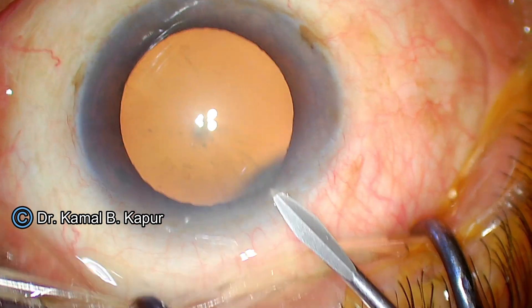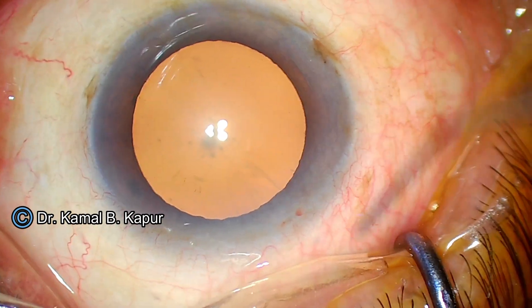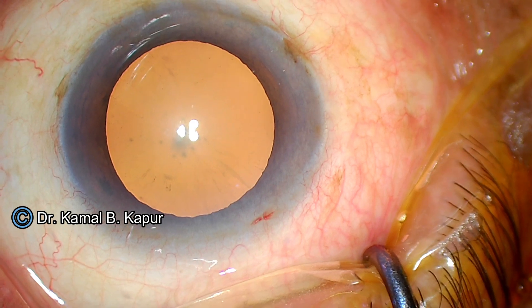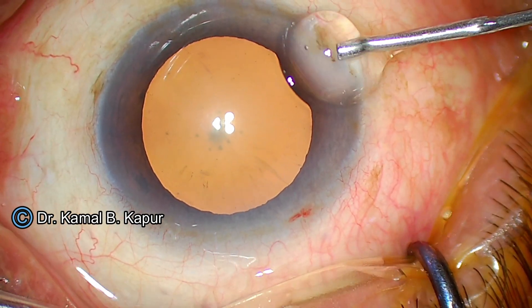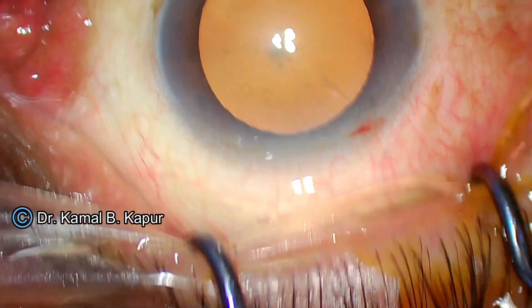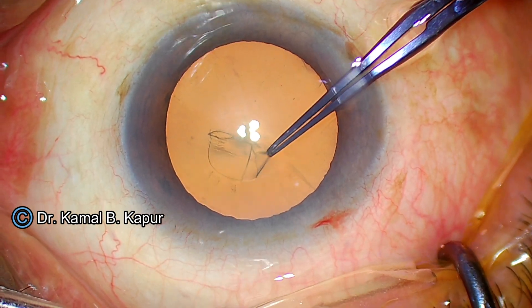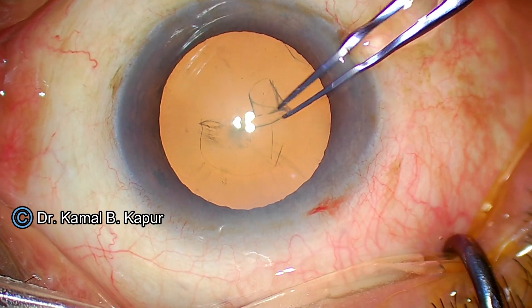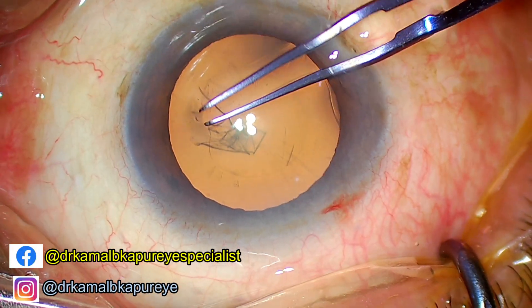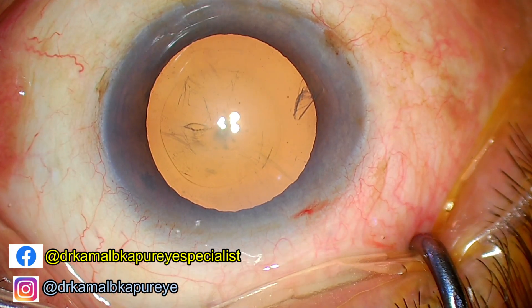This is a grade two cataract — we will demonstrate a peripheral chop, continuing our Back to Basics series. Our first session covered vertical chop; now we will perform a horizontal chop. It is always a good idea to have a decent-sized rhexis. A vertical chop can be performed with a small rhexis, but for a peripheral chop you need to be careful — if your rhexis is too small, getting under it to complete the peripheral engagement becomes tricky.